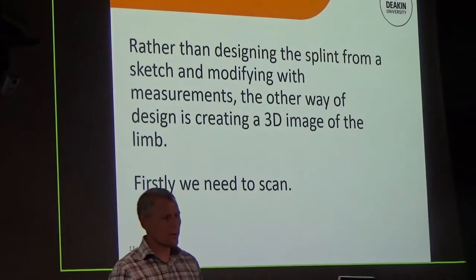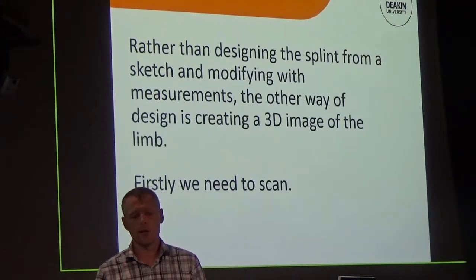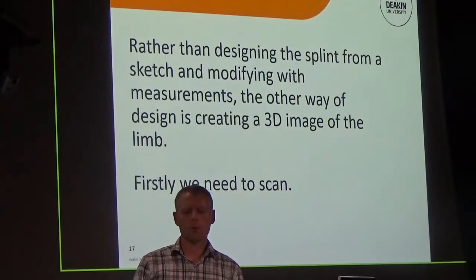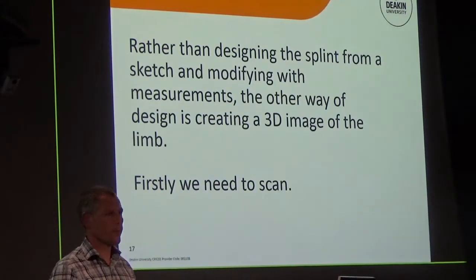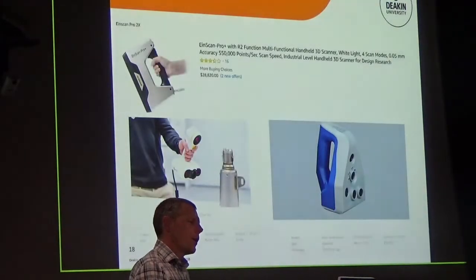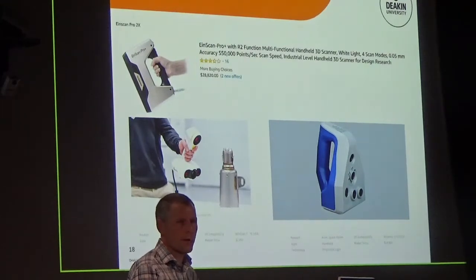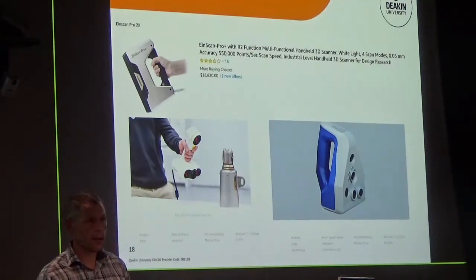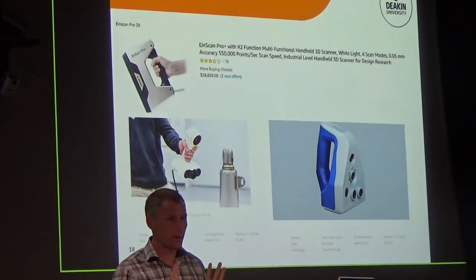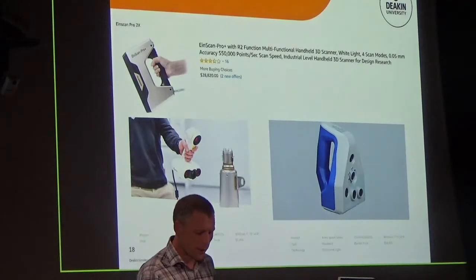The other form that I mentioned in terms of software is that actually you can use a scanning process. So you can actually scan things, and we'll have a quick demonstration of how you can scan things. So you can either draw them from a sketching point of view, like I've demonstrated, through simple circles and things, or you can scan them. So scanning devices are pretty expensive little devices. The spider one, the blue and grey one, we've used that one in the past, and it's a handy 25 grand. But it picks up the minor hairs on your arm. That's how good the quality is. What we need, probably not so much.